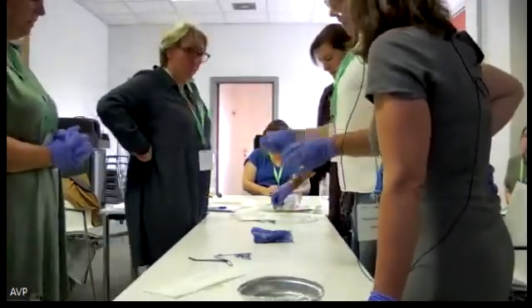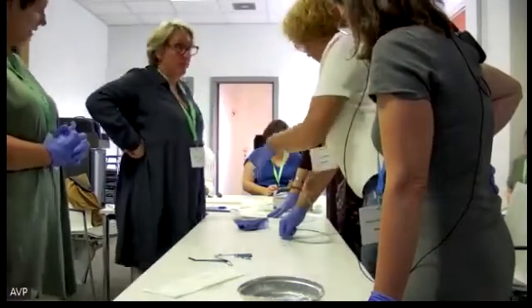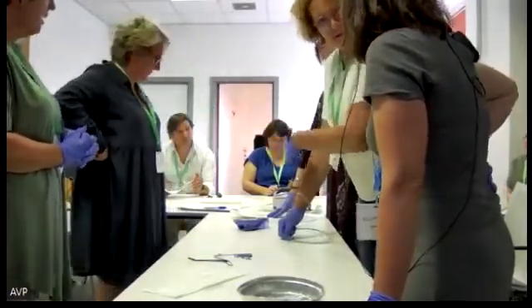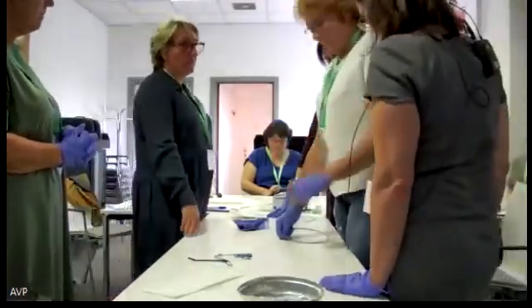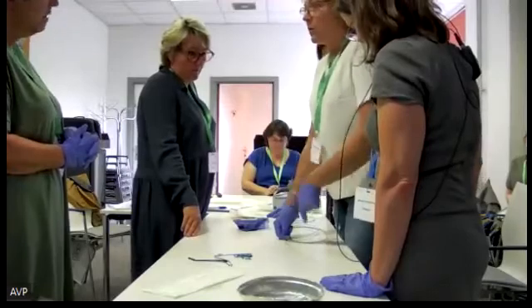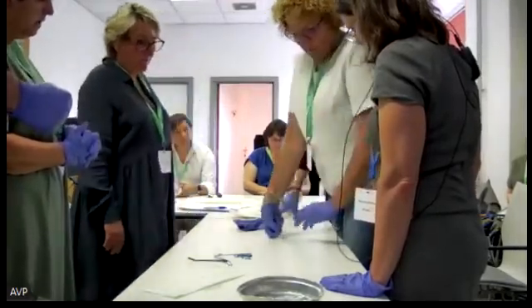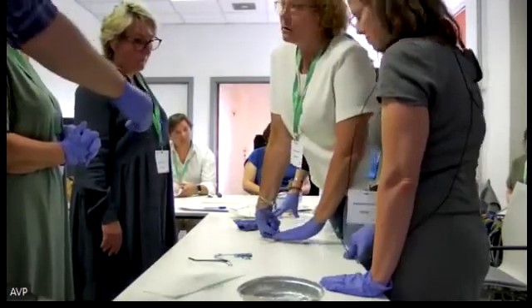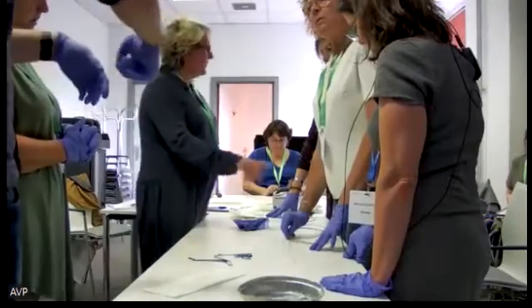Okay. So if you want to have a torque with the wire, you have a torque device in the packaging. In the packaging, you have the Torx. You put them. Some guys don't have torque. So if I put loops like that, if I turn my loop, I'm torquing the wire. That's interesting. So you need to loop with the wire, you have to loop with the wire, and then you can just turn your hand.